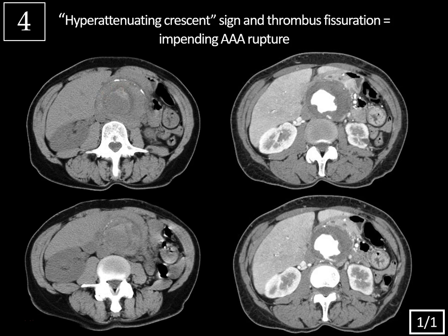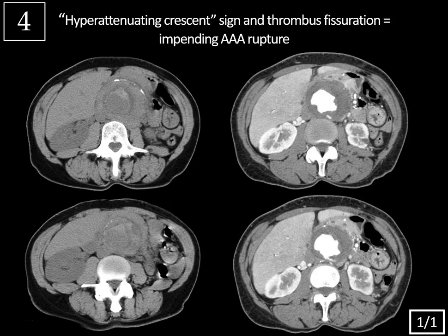The hyperattenuating crescent sign and thrombus fissurization are both findings that raise suspicion for impending AAA rupture. The hyperdense crescent sign is caused by fresh blood that first insinuates into the mural thrombus and then penetrates into the aortic wall — different from intramural hematoma, where hemorrhage starts within the wall. Even without frank rupture, studies show over 90% specificity for complicated aneurysm when you see the hyperdense crescent sign. Other findings of potential rupture include thrombus fissure, aneurysm greater than 7 cm in the abdominal aorta, and evolving discontinuity of calcification around an aneurysm.